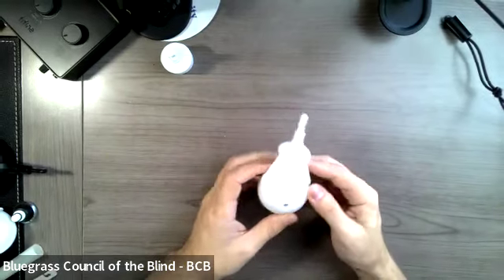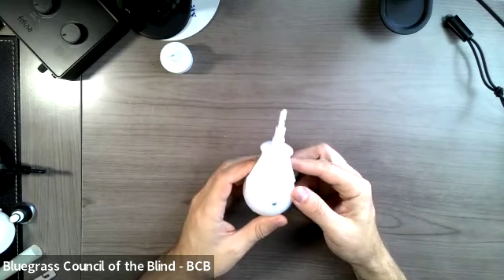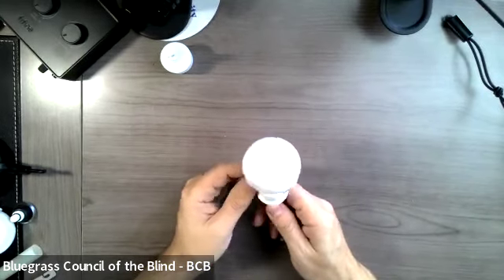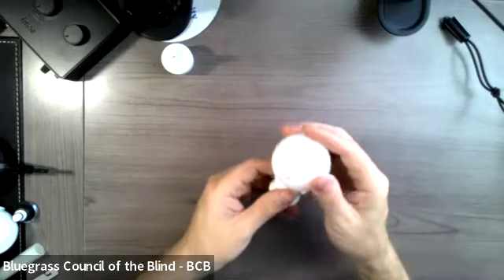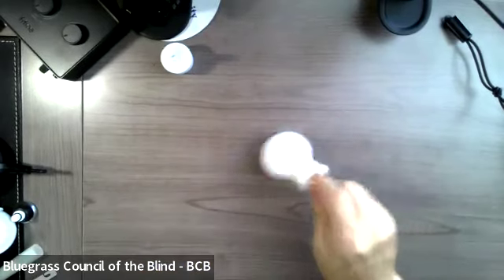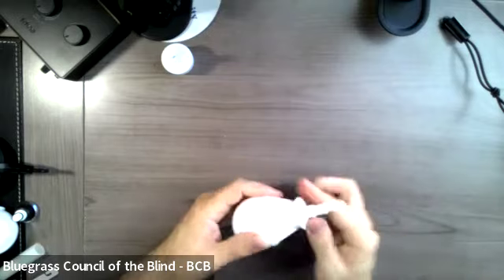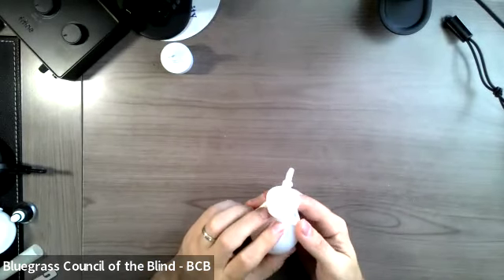And then the last tip I want to talk about is one of their brand new tips. This is the Pathfinder 360 tip. It resembles a large rolling ball tip, but this is a 360-degree rolling tip. So it will roll sideways laterally, but I can also roll it forwards. If you're using this on the end of your cane, you can roll it in any direction, side to side, forwards, backwards. It rolls in any direction. So that's why it's called the Pathfinder 360. So interesting new tip, brand new, just out maybe a year or two.